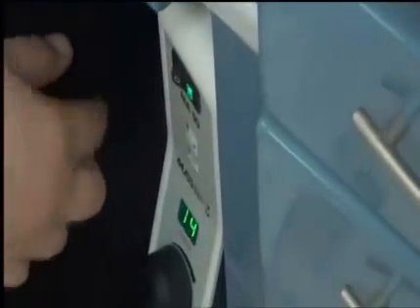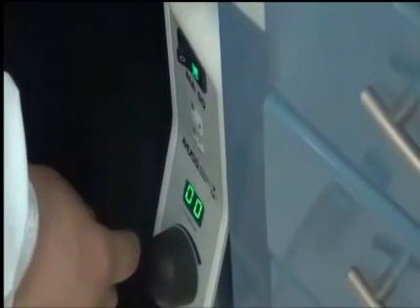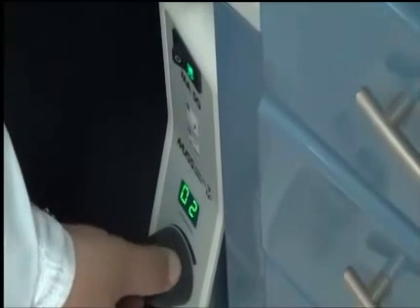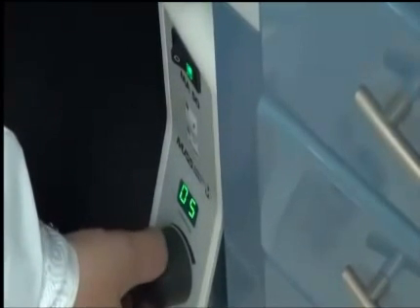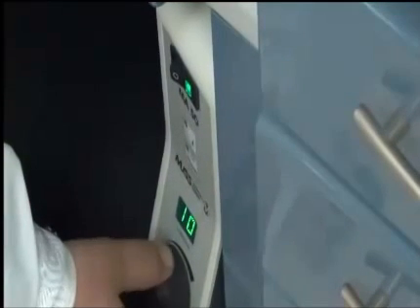You can see here that this is the on and off button, and this is to control the speed. If I press to operate this, it will not work because it's on 0 speed. If I raise the speed, the handpiece will be working faster. You can notice that from the sound of it. We could put it to the maximum speed, and we're going to use what we call knee control. So my knee, I press it against this large button, and it will operate the handpiece automatically.